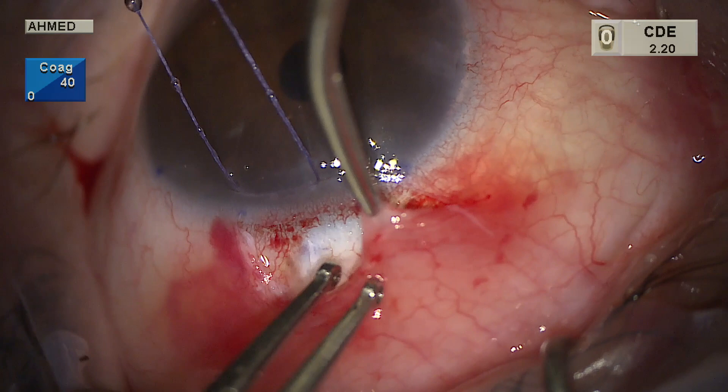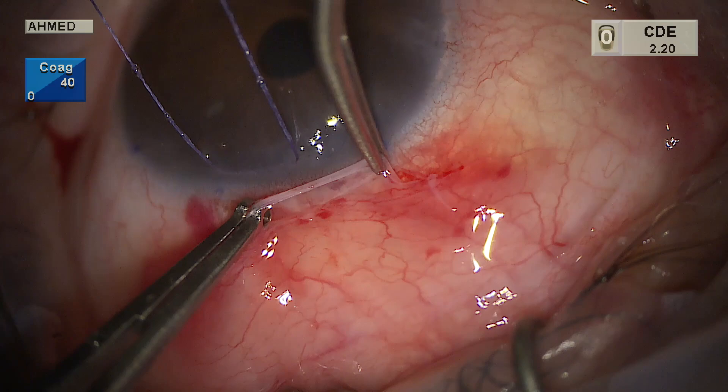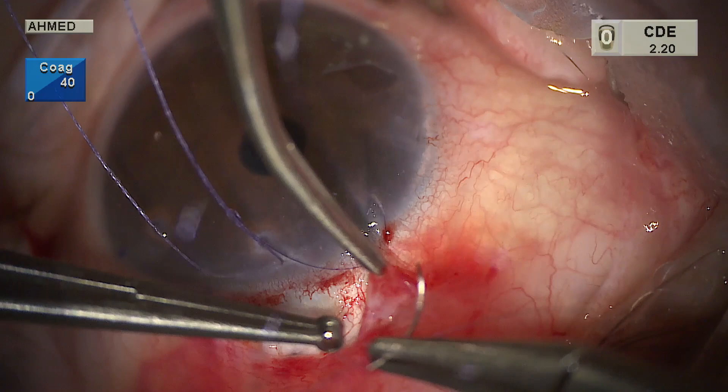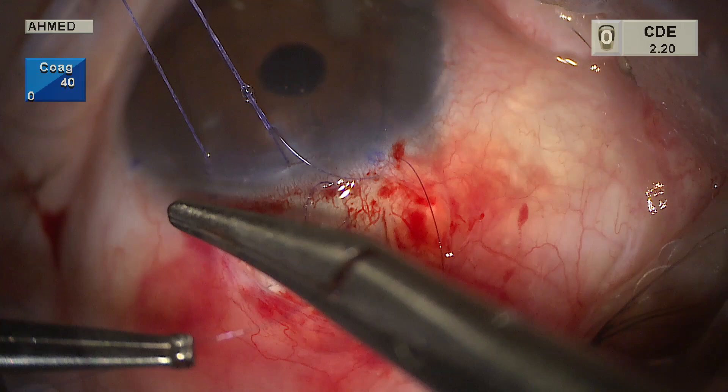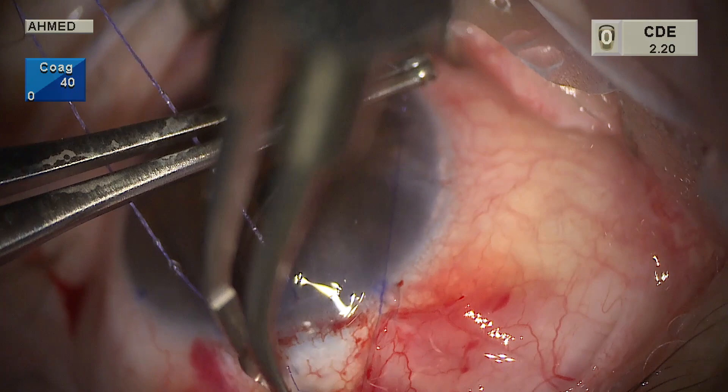The closing technique is important — it must incorporate both Tenon's and conjunctiva. Leaving Tenon's behind creates a Tenon's stump, and anteriorly the conjunctiva can be quite thin, leading to a central avascular bleb. A non-absorbable suture is used, placing the needle through conjunctiva and then Tenon's to bring Tenon's forward along with conjunctiva to the limbus. This technique allows the suture to be buried. Monofilament reduces inflammation from suture resorption and provides a nice closure.